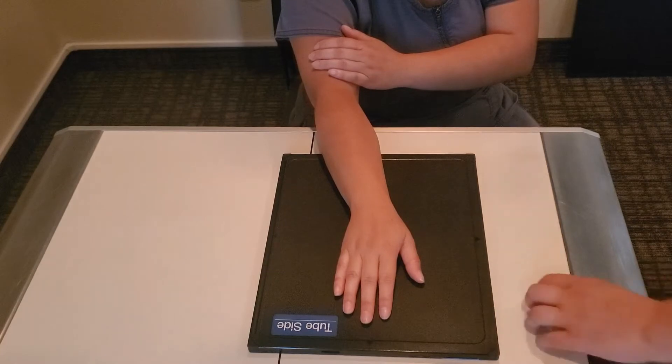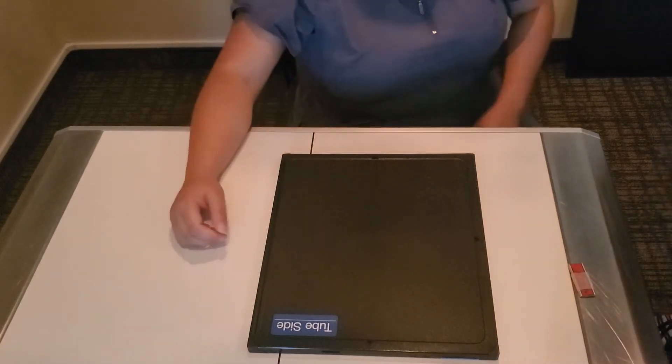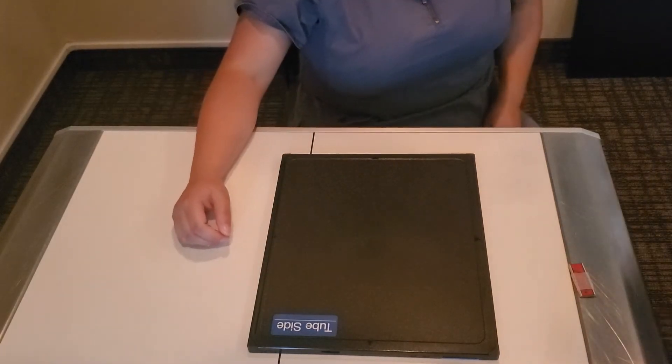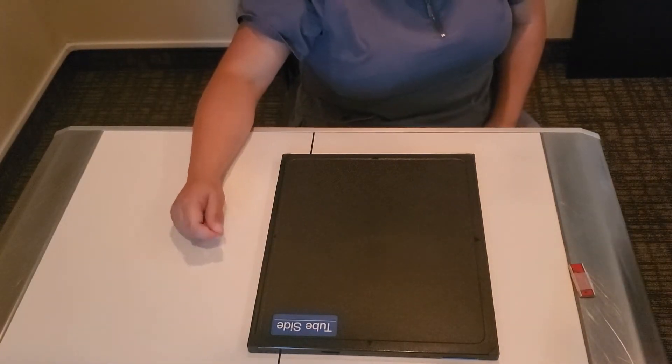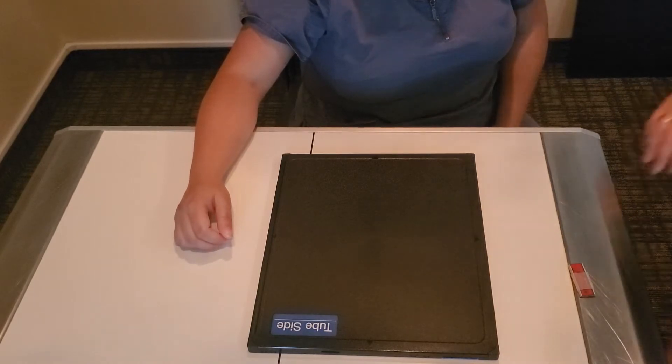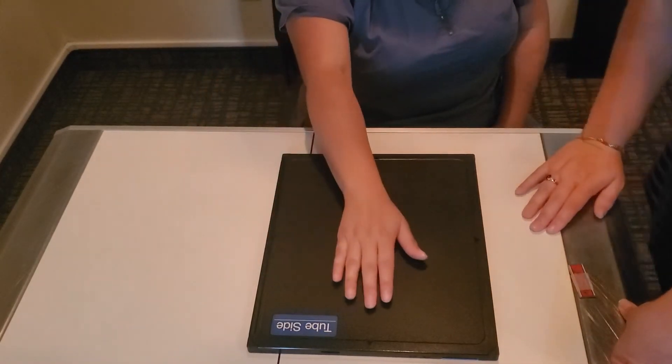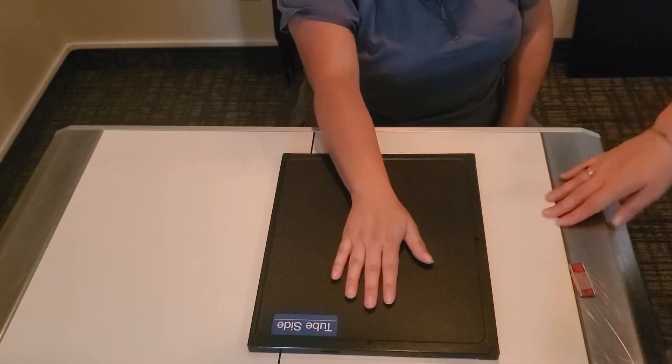Okay, so the last body area that you could be tested on for this next proficiency is the wrist. So I'm going to have you rest your hand flat down.